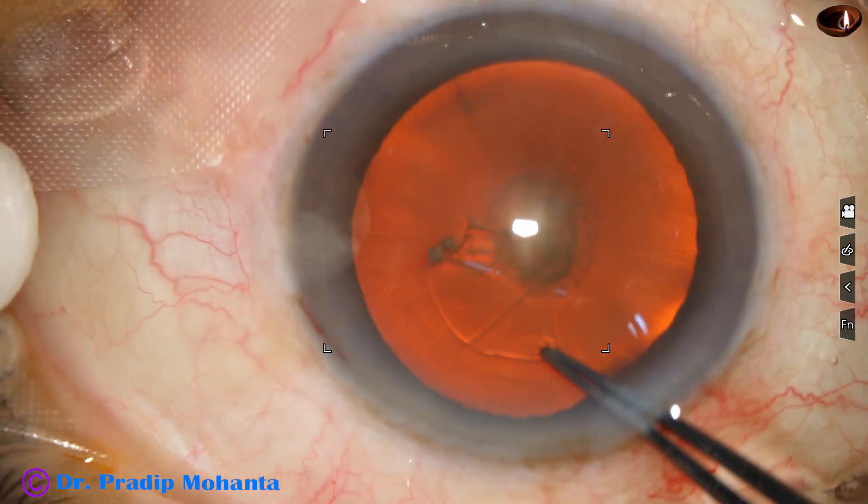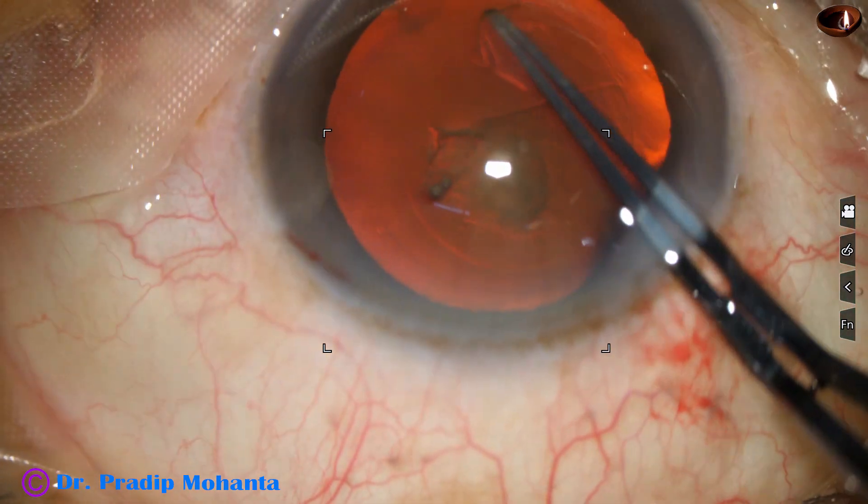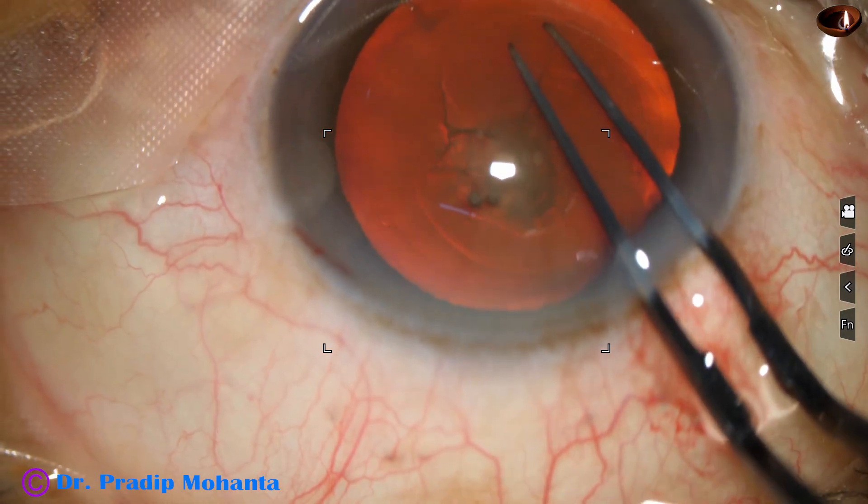Capsulorhexis is being done. The size of the rhexis is going to be about 5.5 mm.